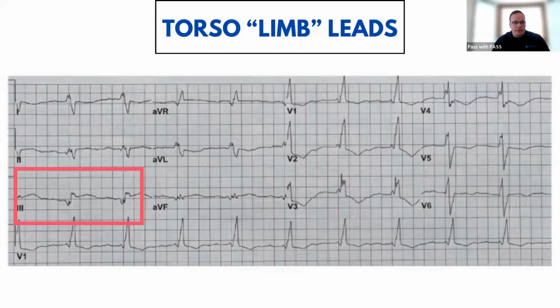So this is just a real quick example of limb leads being placed on the torso, and then on the next slide, limb leads being placed on the limbs.